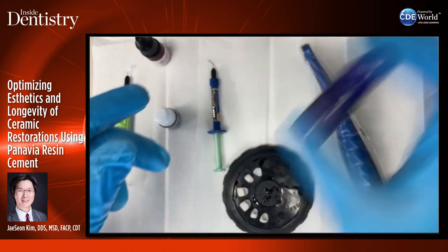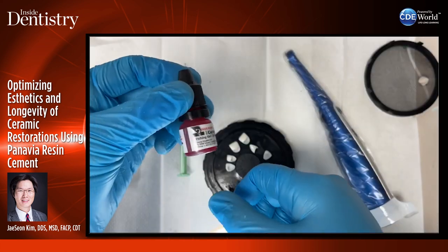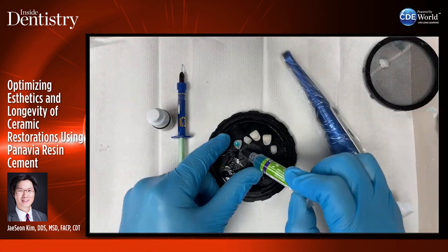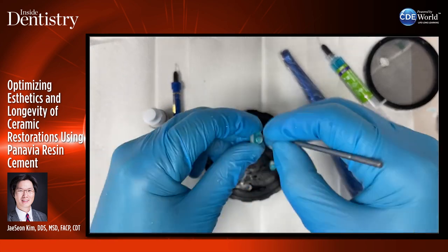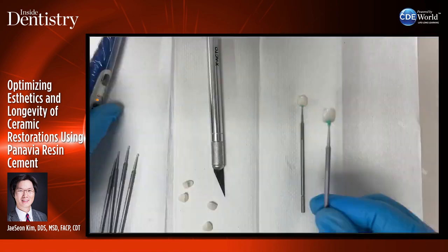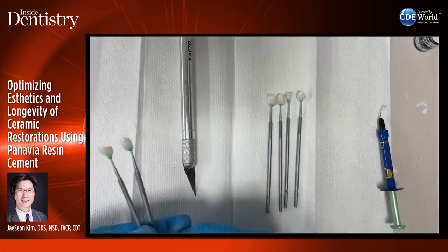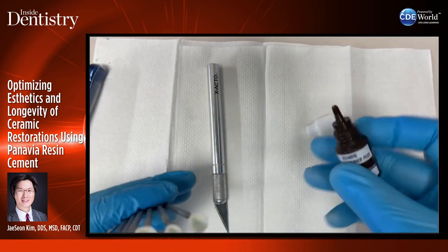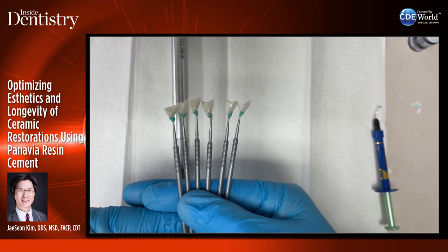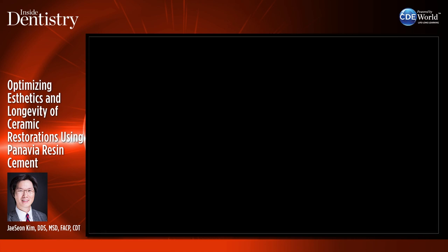Here is a video showing how I prepare my restorations in the lab after try-in. I use Katana Cleaner to decontaminate, then hydrofluoric acid — etch for about 20 seconds, rinse. Then phosphoric acid — this is for lithium disilicate restorations — scrub it in and agitate. I put distilled water in the ultrasonic, then use block-out resin on microbrushes — I call it making lollipops. Then I add Clearfill Ceramic Primer, remove the excess. I use a hair dryer to dry off the excess, and put Vaseline around the outside so the cement doesn't stick to adjacent restorations.